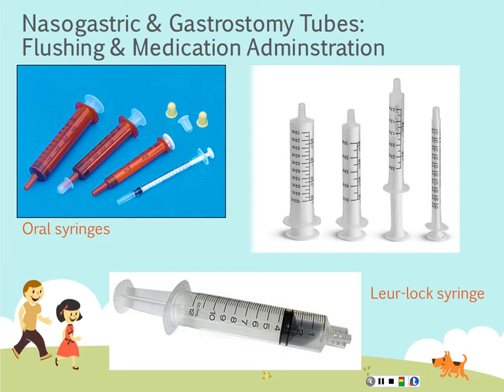If you'll note on the left, you have a darker color oral syringe. Those are very easy to see. That amber color, it's an oral syringe, very hard to confuse with a Luer-Lok syringe. The problem when you use those, sometimes it's hard to see the meniscus because it's very dark. So when you're checking, especially if someone pre-filled the syringe and sent it from pharmacy, you always want to make sure the amount that's supposed to be in there matches the actual volume that's in there.